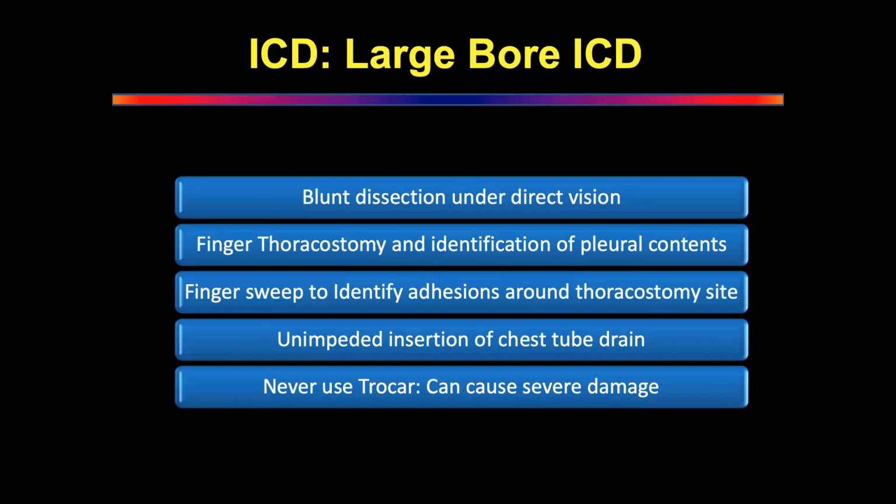Never, ever use trocars. I want to clarify this to everybody. I don't care whether you do it or not in your practice, but good guidelines say you should not use trocars. It is actually banned in our hospital. We don't allow it.